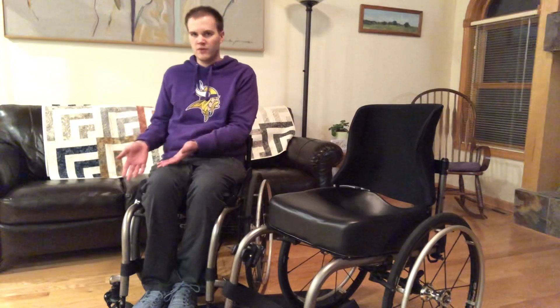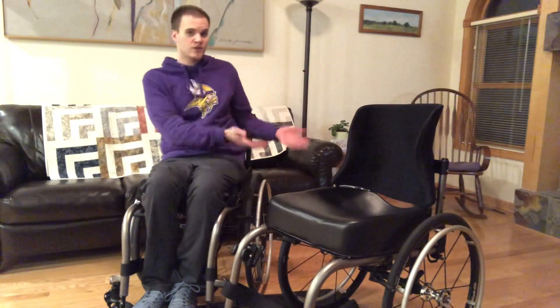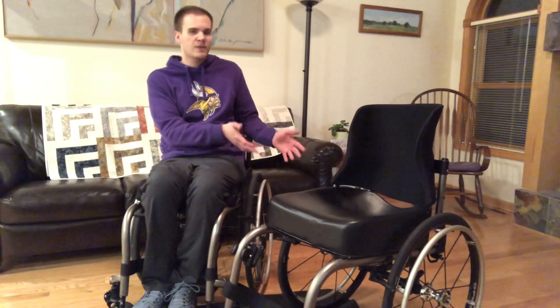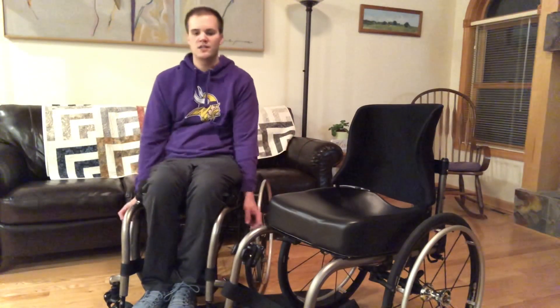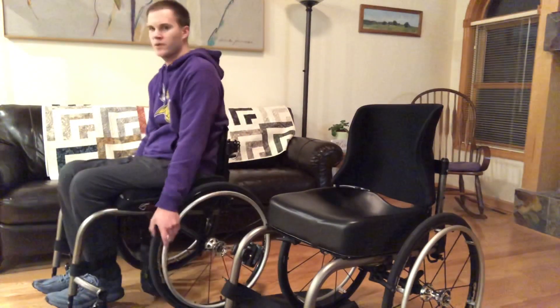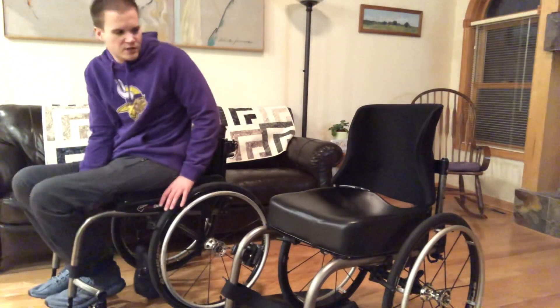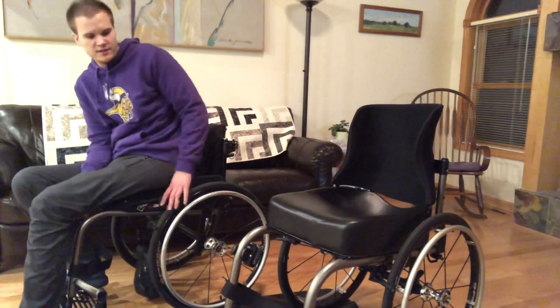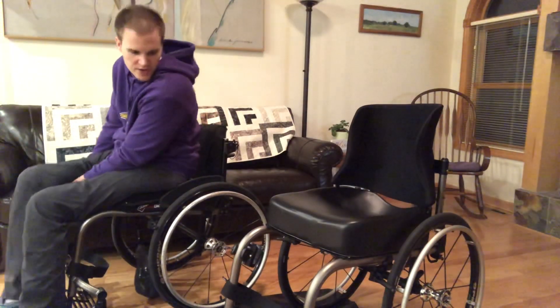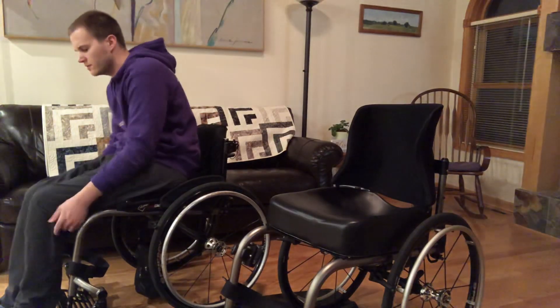So right now I'm actually going to do a floor transfer and then also try to do a floor transfer from this chair — I've yet to do it from this chair but I also sit a lot higher. To start I'm just going to go on the floor, and I'm not too concerned about going on to the floor from that big chair. I feel like it would be fine, so the main thing is just getting up — let's try that.